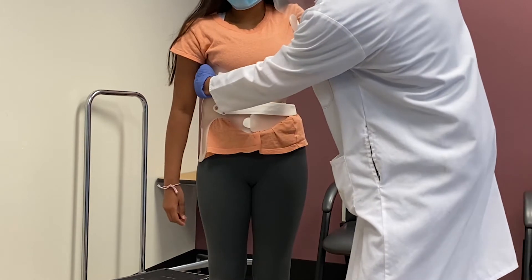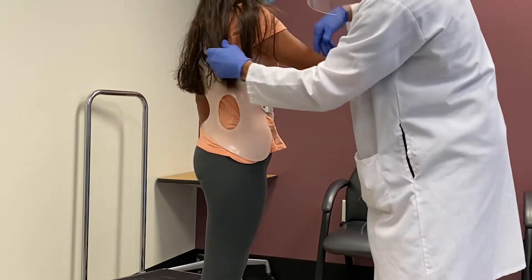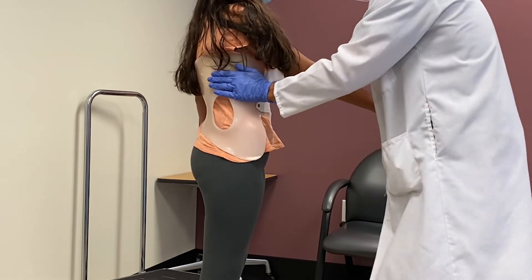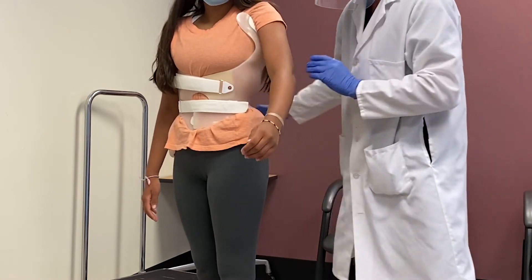This is a counterforce to the thoracic push. Rotating Navia, you'll see the pad pushing on the thoracic spine. This is called a saddle, and this is the counterforce to the thoracic push.